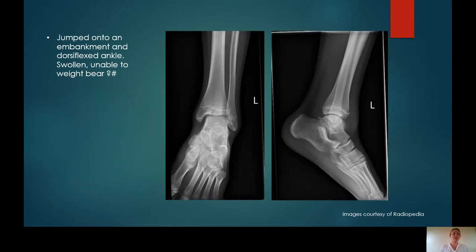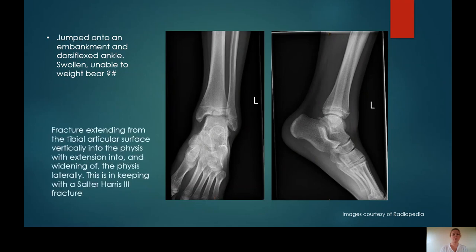Case 8: Jumped onto an embankment and dorsiflexed ankle, swollen, unable to weight bear, query fracture. You can see a fracture that extends vertically from the tibial articular surface, involves the physis, and then there is widening of that distal tibial physis adjacent to the syndesmosis joint. The fracture has run up from the articular surface involving the physis and then transversely along the almost fused physis. This is in keeping with a Salter-Harris type 3 fracture.